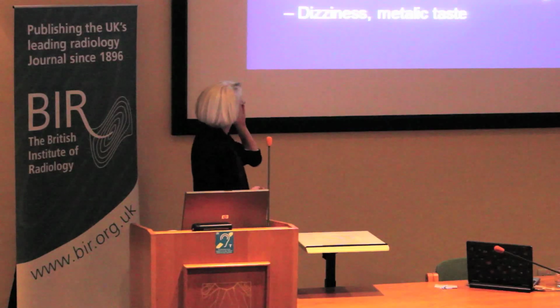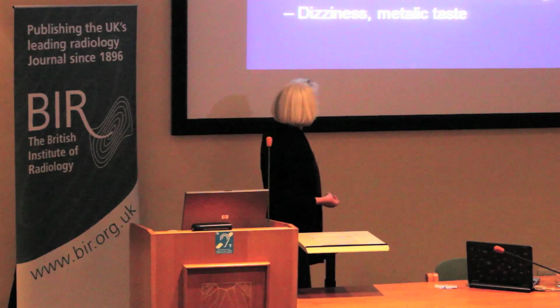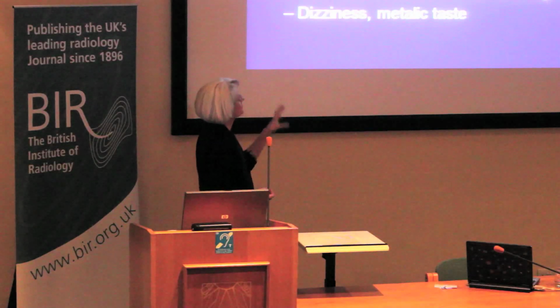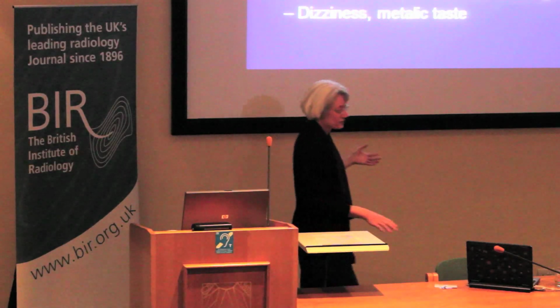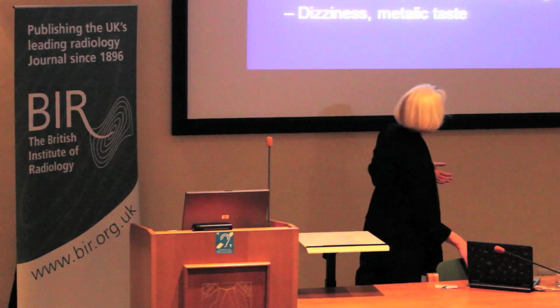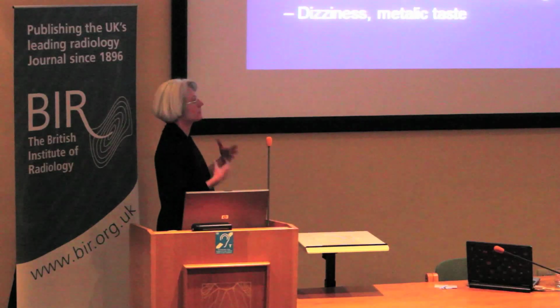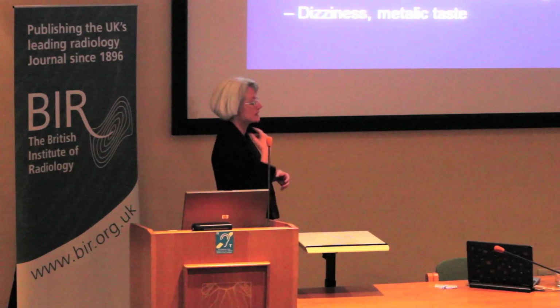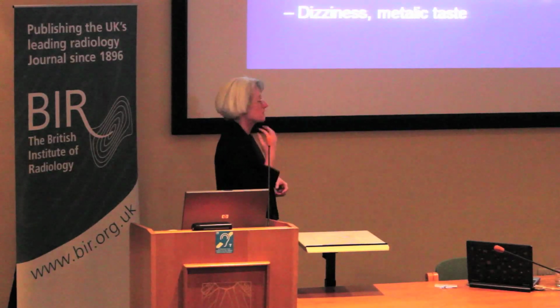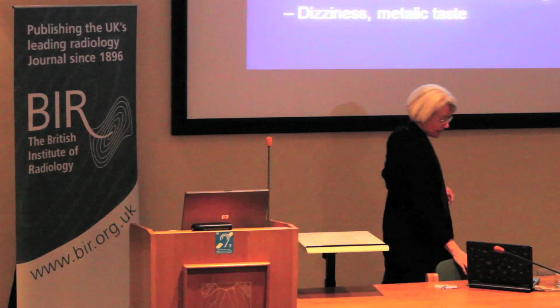There is some evidence of expression of gene pathways being altered. We know there's some evidence that magnetic fields will affect growth patterns in cartilage. And we've done a lot of work at Nottingham looking at the effects of magnetic fields on sensory effects. So we know magnetic fields will make you feel dizzy if you move in the fields. This is almost certainly due to electric currents induced in your ears. You get a metallic taste at high field, moving in the field, due to currents induced in your mouth.